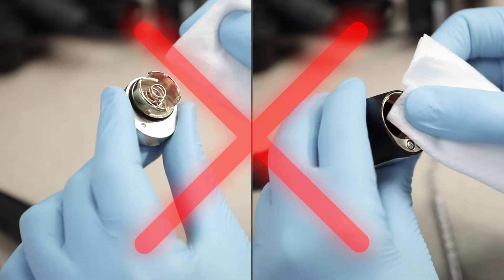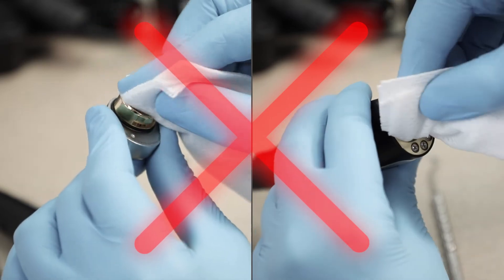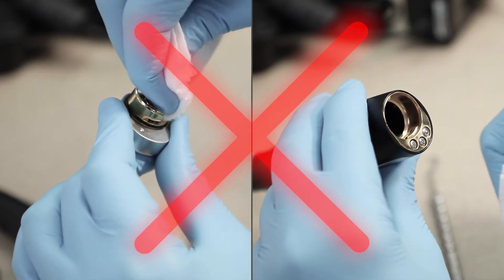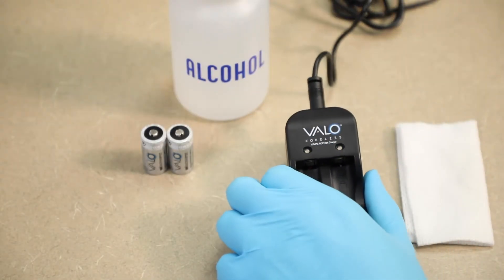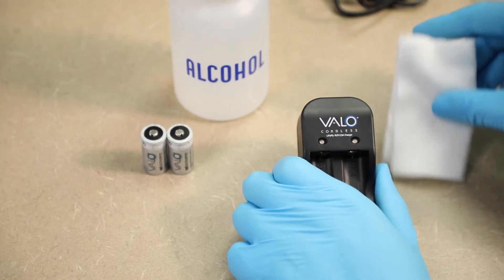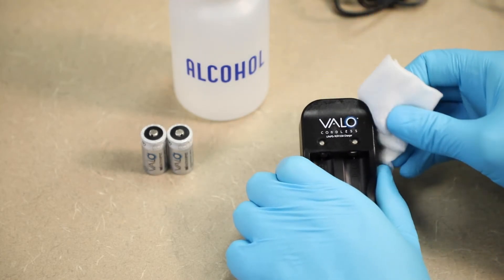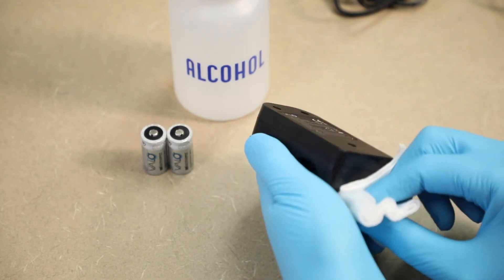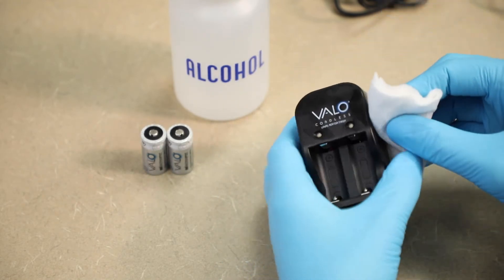To avoid damaging the equipment, do not attempt to clean the gold contacts or any part of the battery compartment. If cleaning the battery charger becomes necessary, unplug the charger, dampen a cloth with isopropyl alcohol, and gently wipe the surface of the charger or batteries. Let the charger dry completely before resuming use.